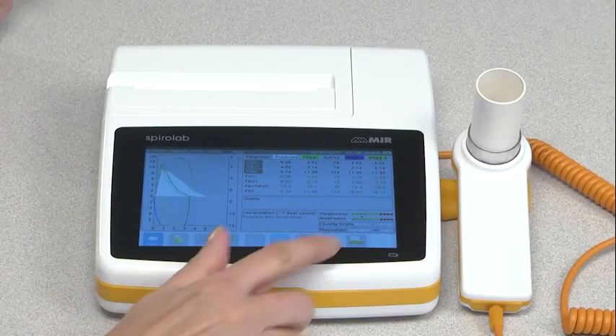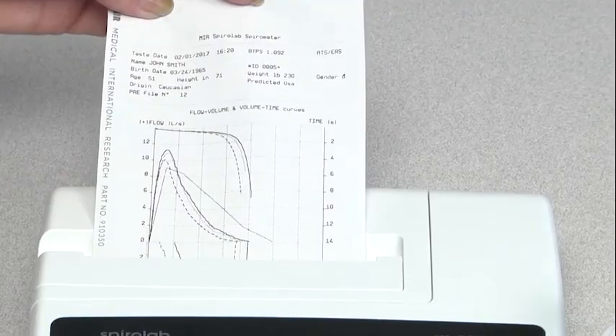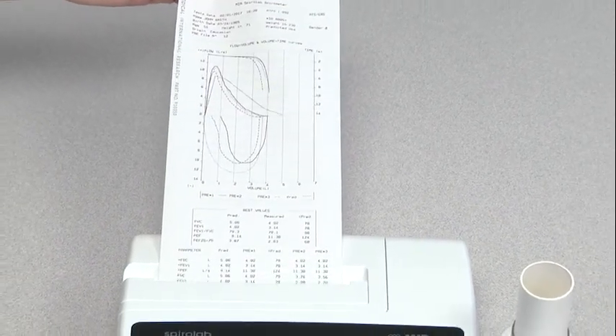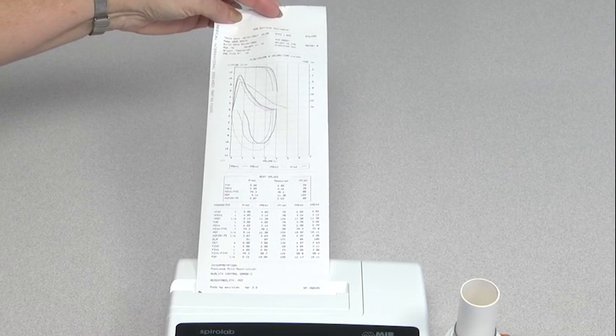After you have your three tests, press the Print button to get a printout of the test results from the built-in thermal printer or directly from an external printer. You may also upload the results into the WinSpyroPro software directly or via Bluetooth and print the report from there.